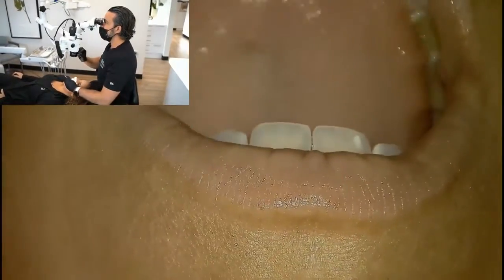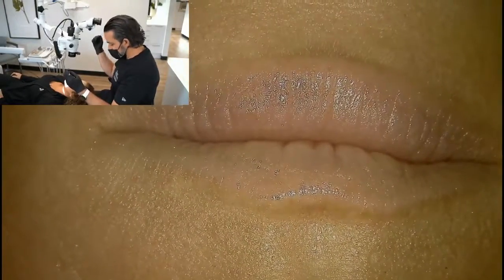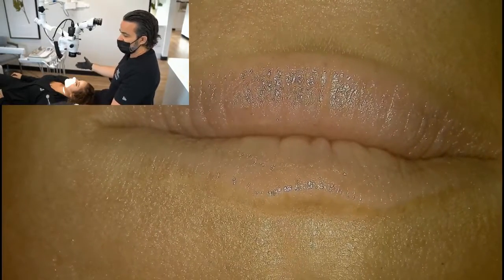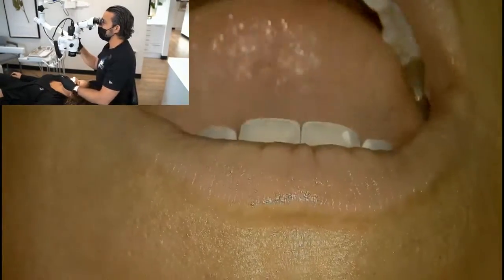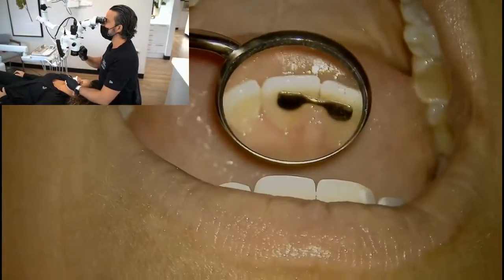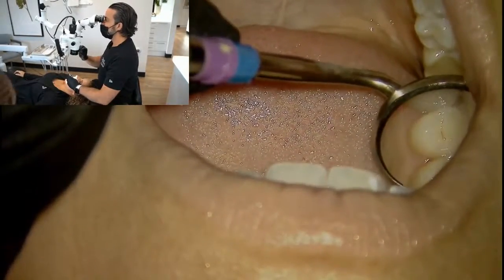When you had loops, it's the same principle, but with loops you would figure it out by bending, or you'd try to lift the chair or do something like that. And that's fine, but it's going to give you a neck problem. So here, I can always just do this, and always just have a little bit of a tweak right here as you look on the screen.